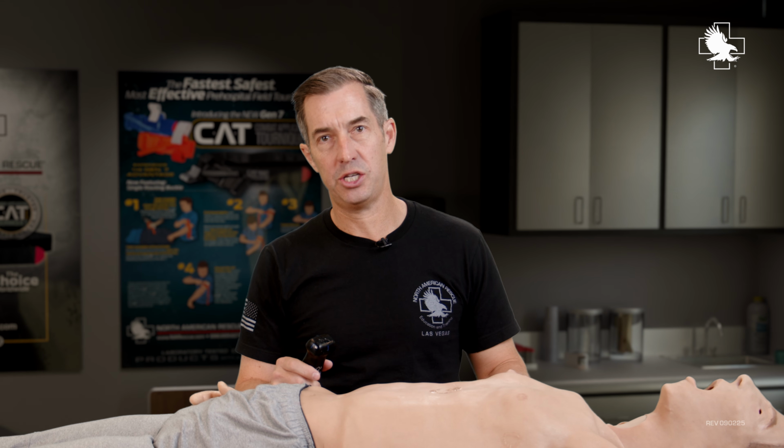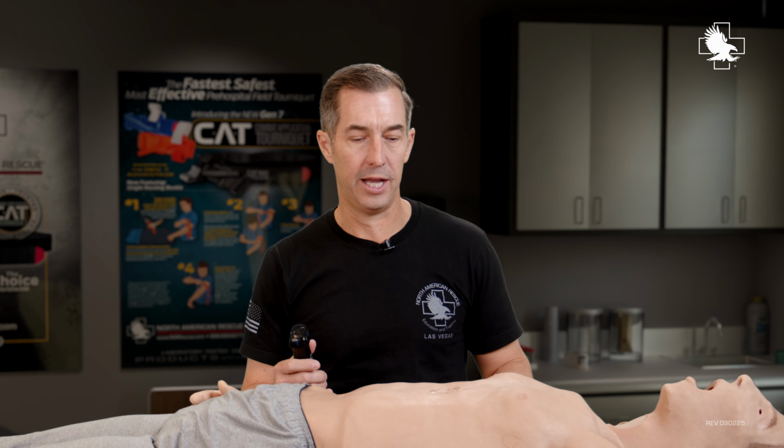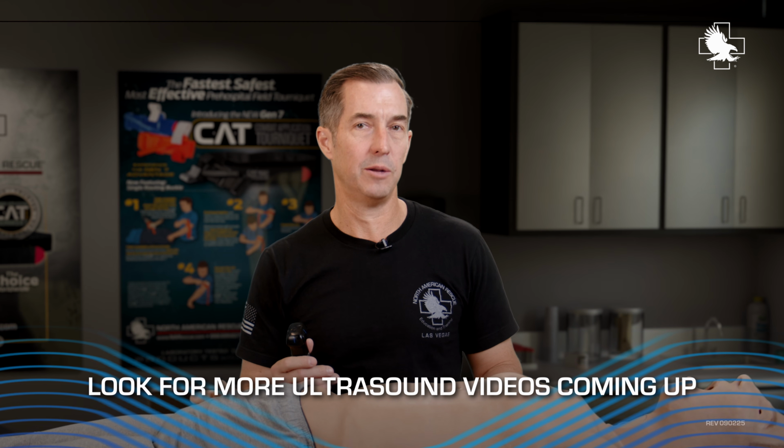There are a lot more tutorials, and there are classes that you can take, including online education. The biggest thing is to just get one of these probes in your hand and start scanning people. The more normal you see, the more quickly you're going to be able to recognize what abnormal looks like. So hopefully that helps you out on doing a FAST exam and shows you some of the things that you're going to be looking for.